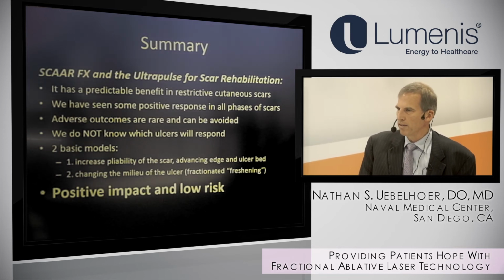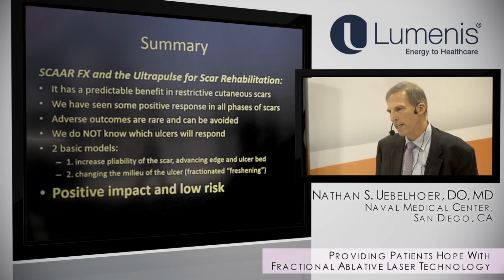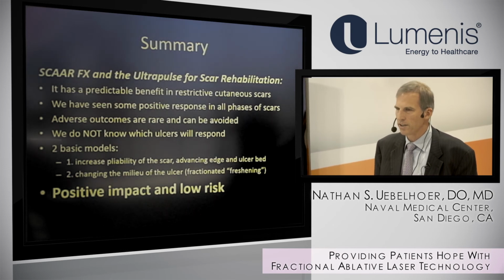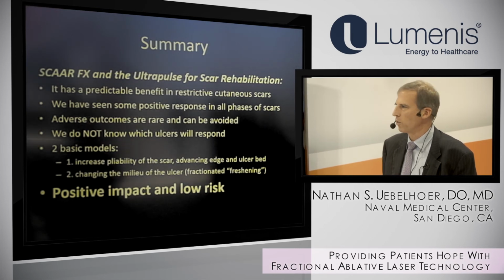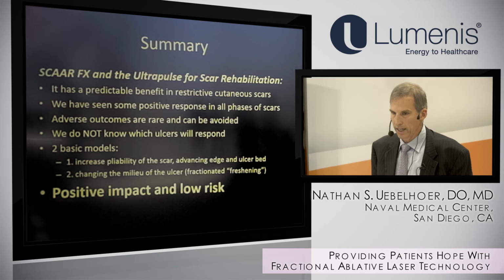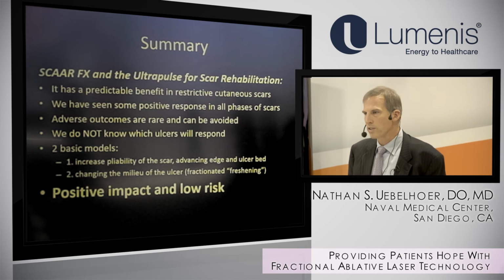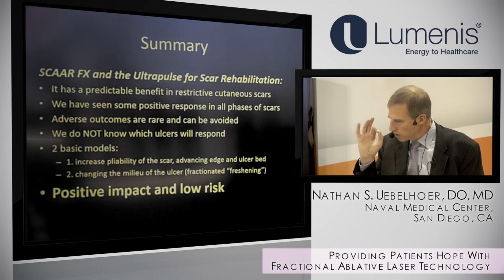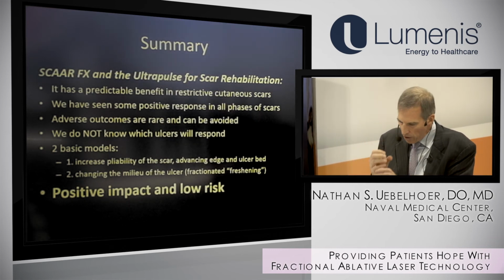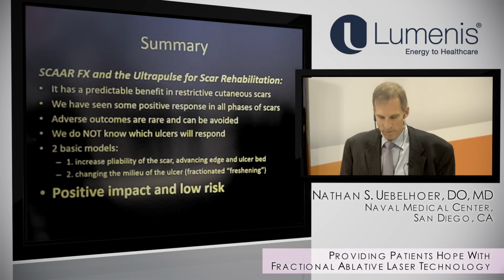There's a lot of things that are going to happen in the future with this. We're delivering medications. I think that's going to be one of the most exciting things. We're delivering medications to treat cancer, to treat other medical issues. But the fact that we can rehabilitate these scars like we never could before 2008 is really exciting. And there's no question, we use a lot of different lasers, but this laser's been our workhorse, and it gives us the optimal result, and it makes sense to us that because we're using such a quick pulse, such a very narrow beam diameter, we're able to get these results. So anyway, thank you for being here, and it's always exciting to talk about this.